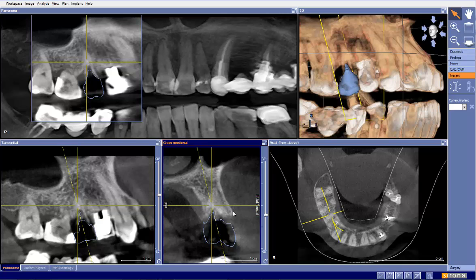We can see that we have a nice buccal plate, we have a nice lingual plate, we do have some apical area for engagement and extension. So, excuse me, my first evaluation of this is that this is a great site for immediate placement. And I'm basing that judgment on a buccal plate being present, a nice lingual plate being present, relatively healthy and level bone, lack of significant infection on the tooth, and apical area for engagement. So just looking at those things, I'm already making the judgment that we can do an immediate placement.